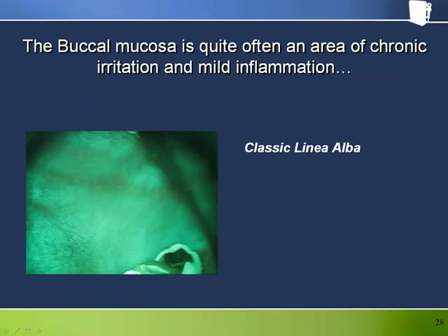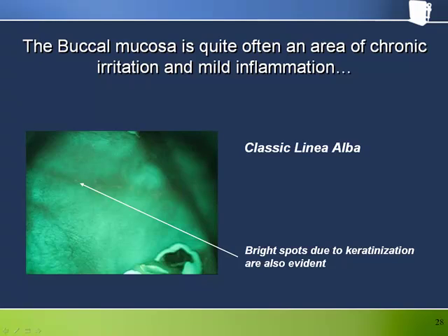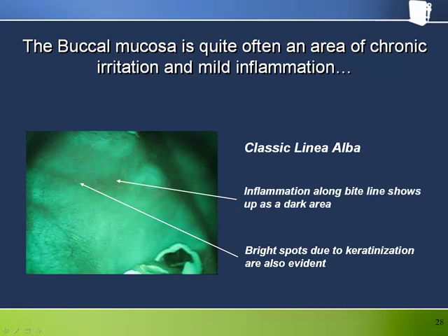Buccal mucosa is quite often an area of chronic irritation and mild inflammation. Here we see a fairly classic presentation of linea alba under Velscope. Under white light, you can see a white line corresponding to keratinized tissue right along the bite line. This can sometimes show up as a bright line under Velscope due to keratin fluorescence, but more typically appears with the associated mild inflammation dominating, showing the area as predominantly dark. Keratin fluorescence can be seen as little bright spots along the bite line, and notice the diffuse borders of the inflamed region as it fades into the brighter green of the rest of the buccal mucosa.